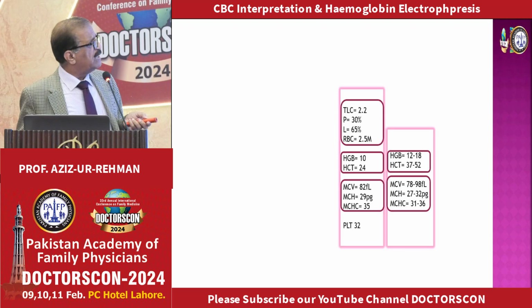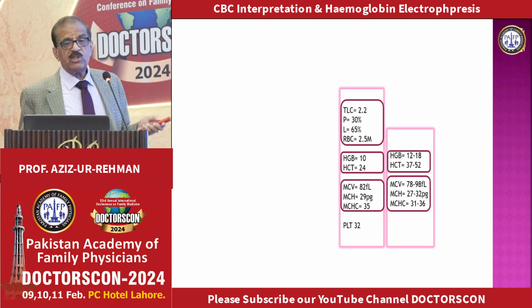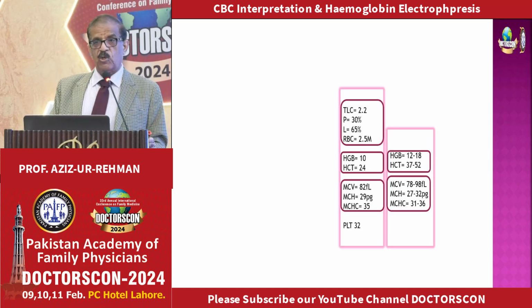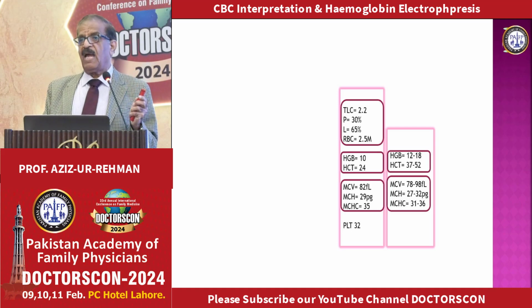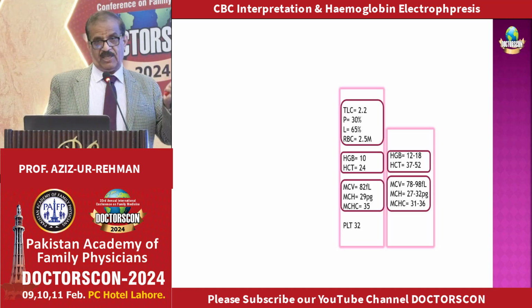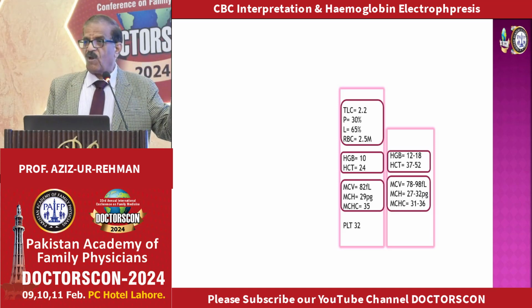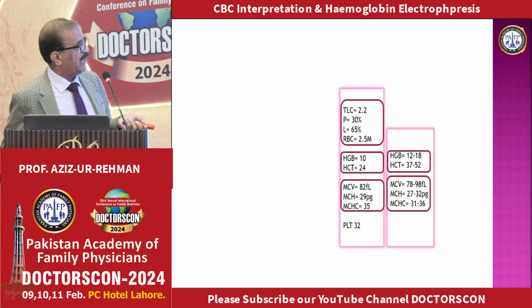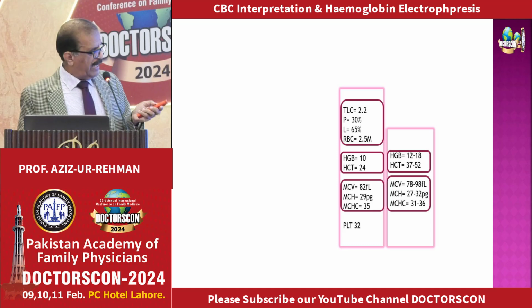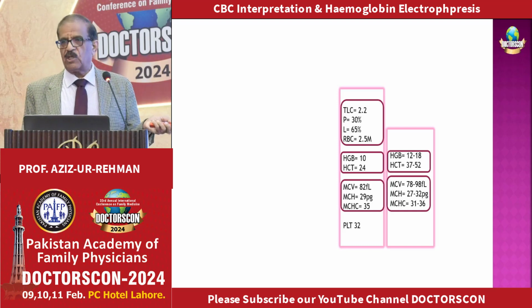So in this case, we will actually have to go to this panel because this could indicate bone marrow depression. A normocytic, normochromic anemia is more likely to be serious. Although from normocytic, normochromic, one might think this is more likely to be normal, it is actually a more nasty thing. So it is more likely to be an aplastic anemia. Look at this report. TLC is less, platelets are also reduced, so it is pancytopenia.